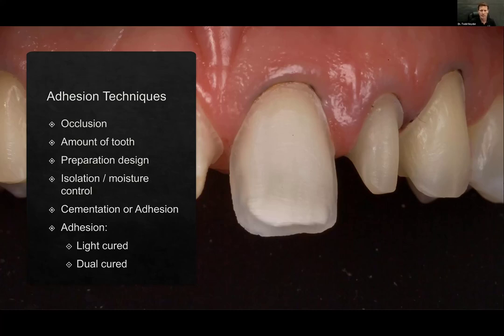Sometimes we're on dentin. And with dentin, we get the highest bond strengths, but we know those bond strengths aren't as long lasting. So obviously in our preparation design, we're trying to stay in as much enamel as possible, or keep enamel on margins so that we can have a nice long-term seal next to the gum line.